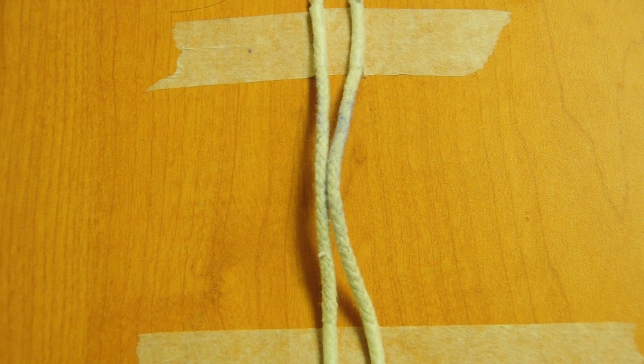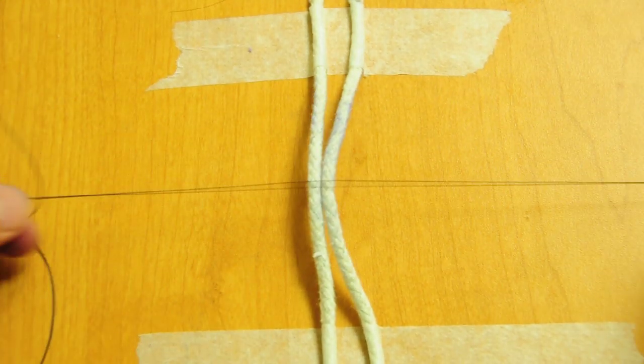Okay, so this will be one-handed ties with real suture. Again, this is O-Silk, no needle.